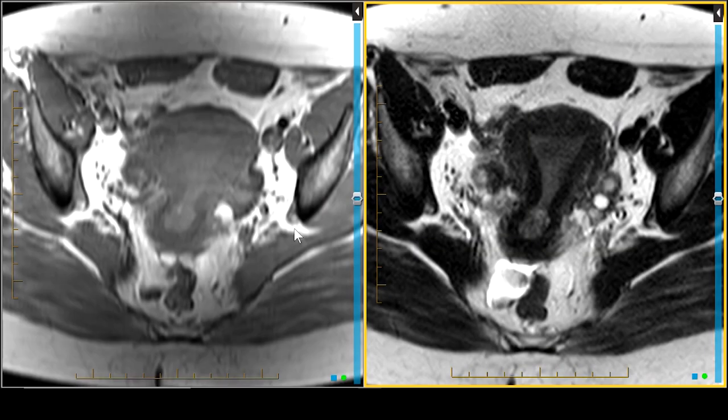We're talking pulsing sequences — basic T1 fat-weighted imaging, anatomy imaging on MRI. What are the strengths of the T1 and what projection should you use? You should probably avoid the sagittal projection for a T1 because it doesn't really show the internal character of the uterus, so that's reserved for the T2 fast spin echo. Your choices therefore are orthogonal or oblique axial and orthogonal or oblique coronal. The obliquity will depend on what you're looking for — if it's a standard exam you'll do orthogonal; if it's an anomaly and we have to see a septum in the uterus, then you're going to have an oblique axial or oblique coronal, which I will show you how to do.